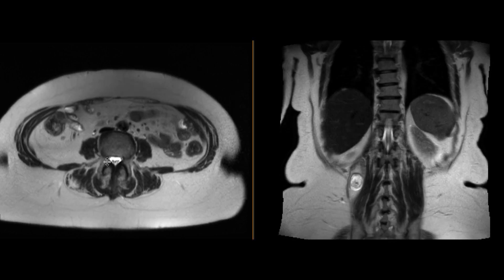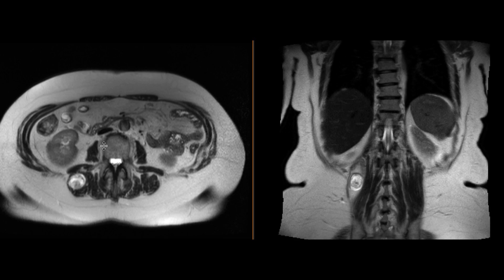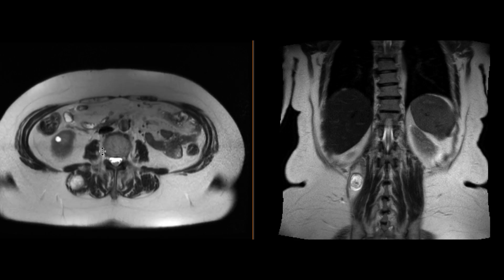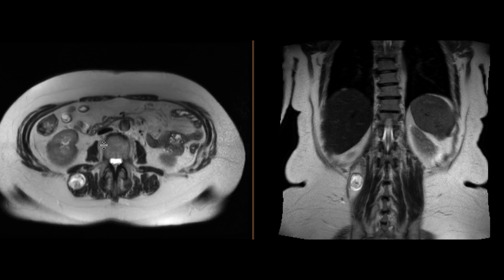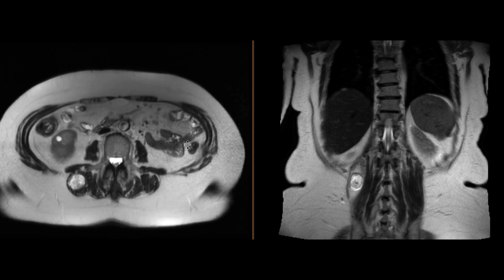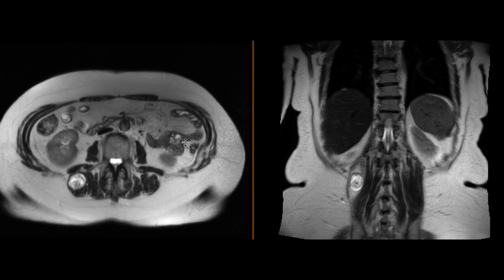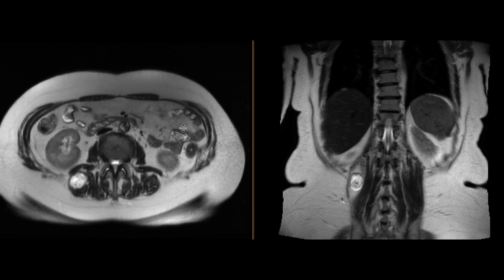In and of itself it's a nonspecific finding, but whenever you see a mass that's pretty well defined, T2 hyperintense, round or oval in shape, and particularly when it has these sort of ring-like structures of T2 hypointensity within it, you've got to think about a nerve sheath tumor. It's thought that these T2 hypointense structures represent nerve fascicles within the nerve sheath tumor — the so-called fascicular sign.